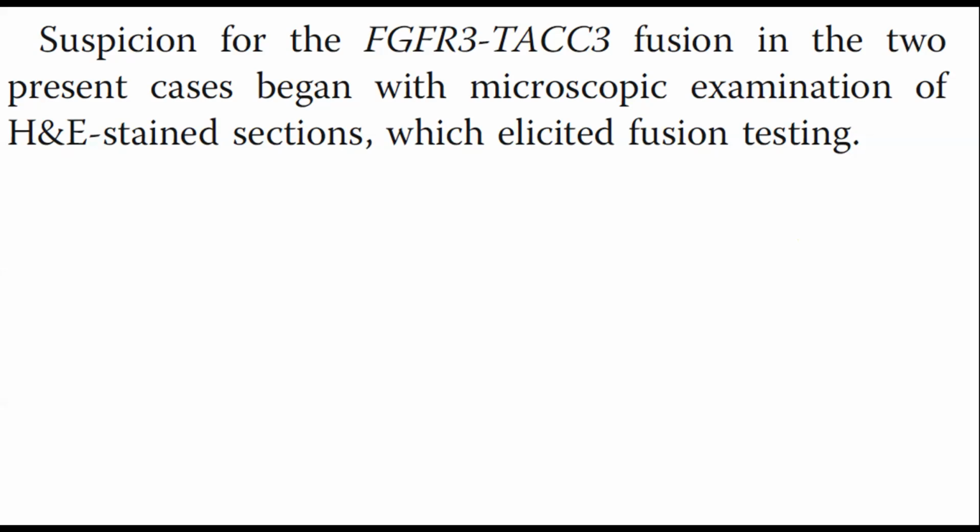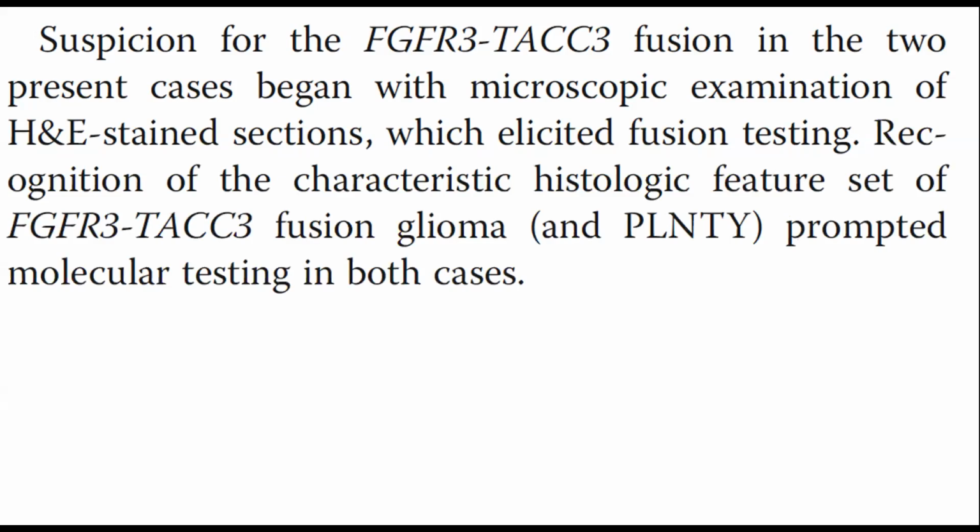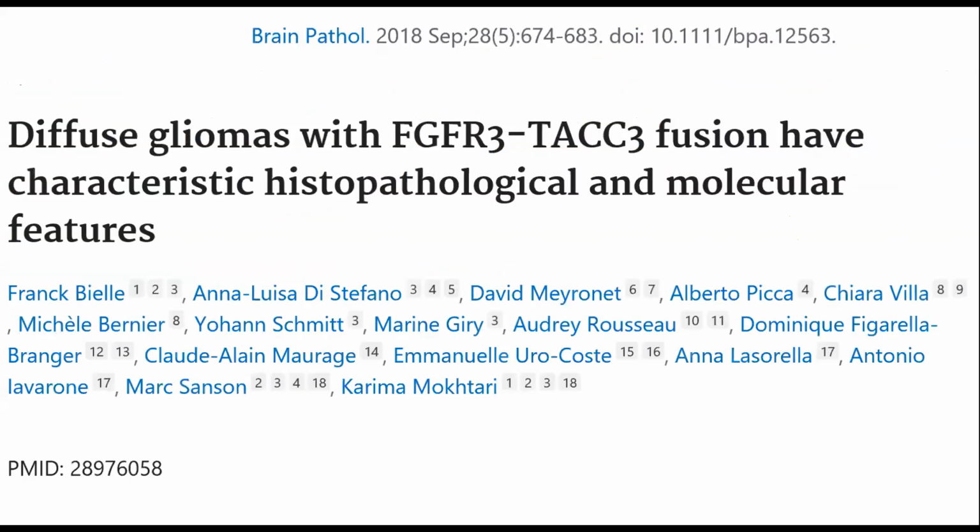And the same thing with the second case, and the same thing with the case that I'm presenting right now. This came up on Tumor Board this past week. There would have been no discussion of FGFR3 TACC3 fusion if the oncologic neuropathologist was not aware of an association, a concurrent alteration in the fusion glioma, which was a point mutation, an additional alteration, a point mutation in FGFR3. Okay. Recognition of the characteristic histologic feature set of FGFR3 TACC3 fusion glioma, and also that they share morphologic similarities, prompted molecular testing in both cases.